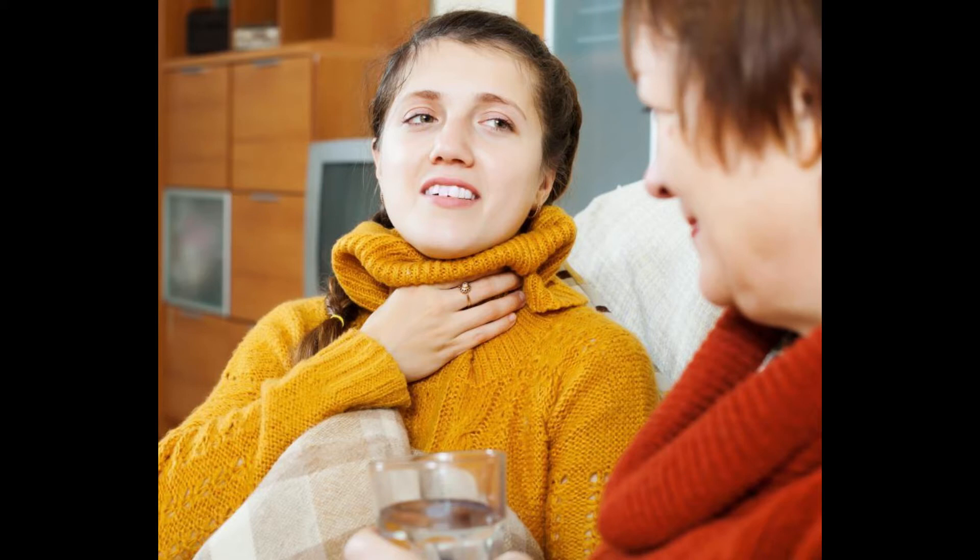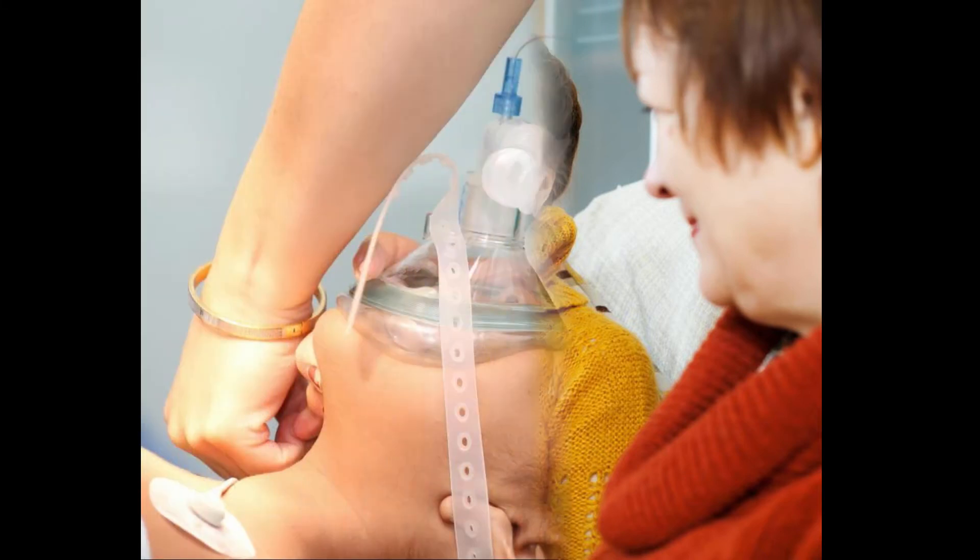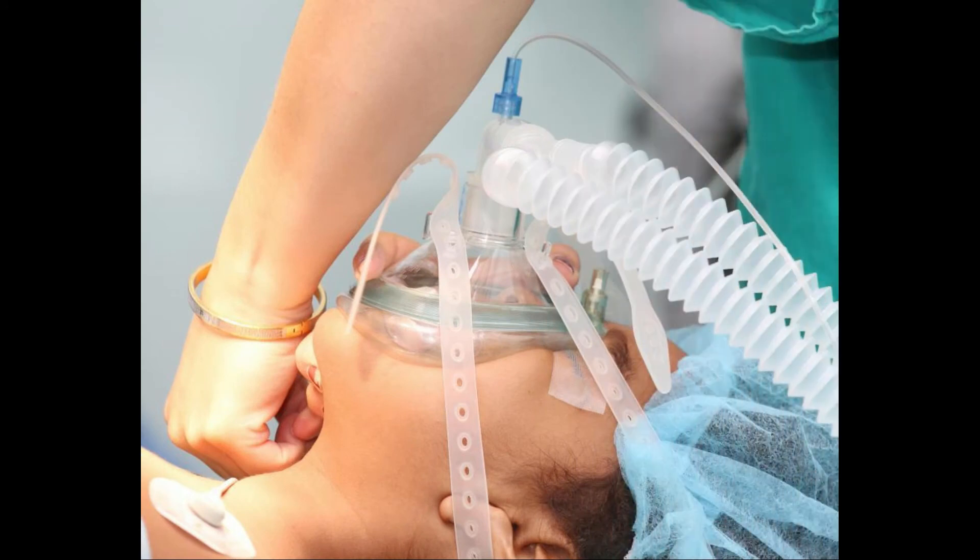Tube placement can be complicated and typically requires heavy sedation for the patient because it is uncomfortable. After approximately 24 to 36 hours, it will be necessary to remove the device and implement a more permanent solution.